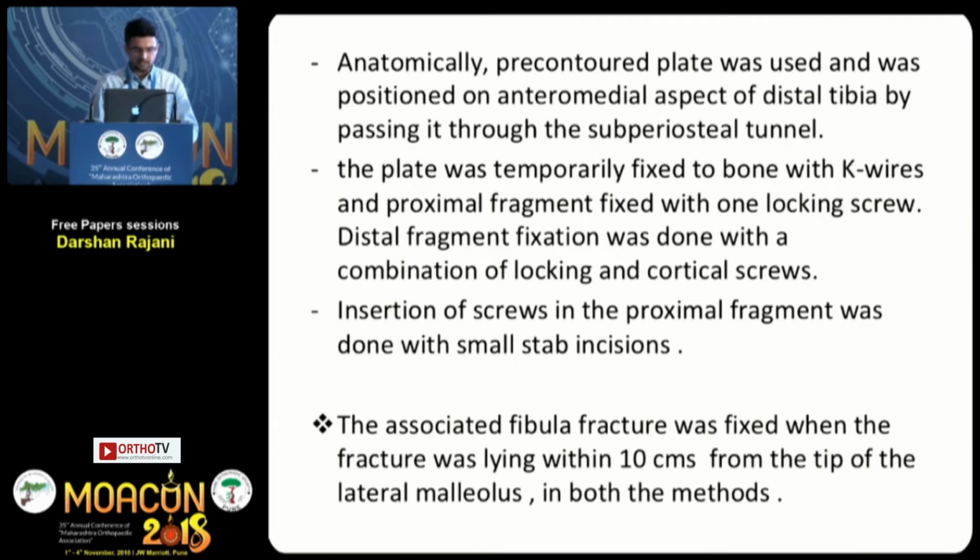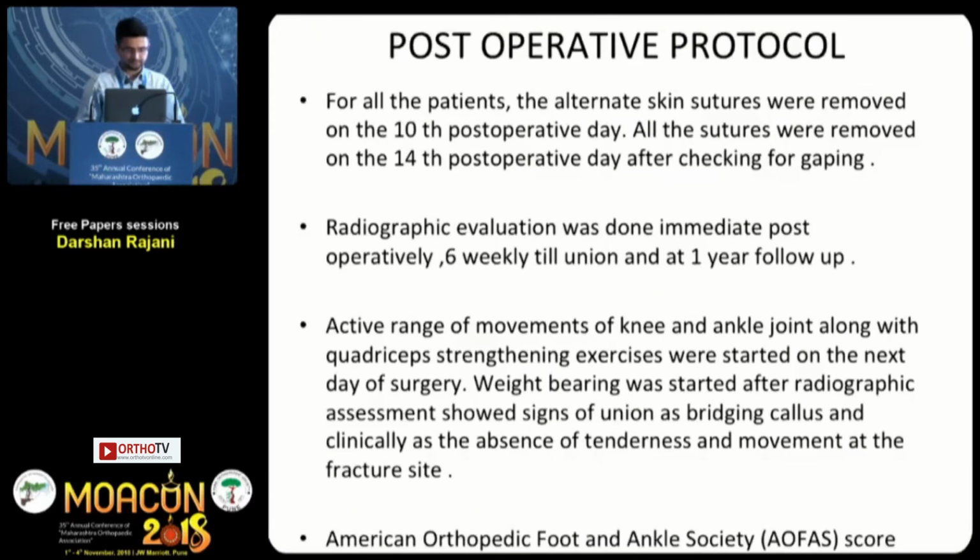The distal fragment fixation was done with a combination of locking and cortical screws. Insertion of screws in the proximal fragment was done with small stab incisions, and the associated fibula fracture we fixed were in the criteria when the fibula was fractured within 10 centimeters from the tip of the lateral malleolus.